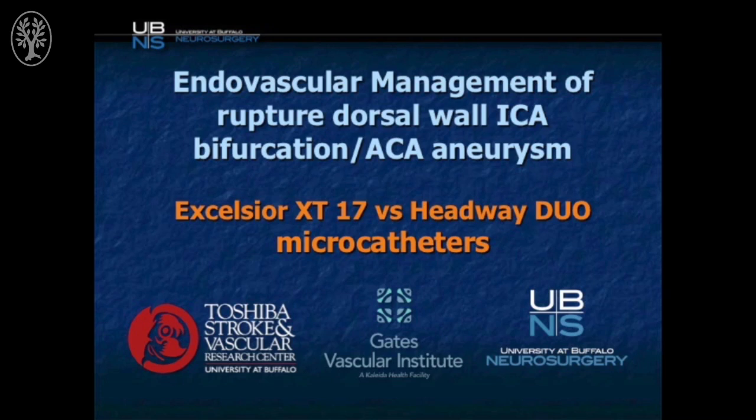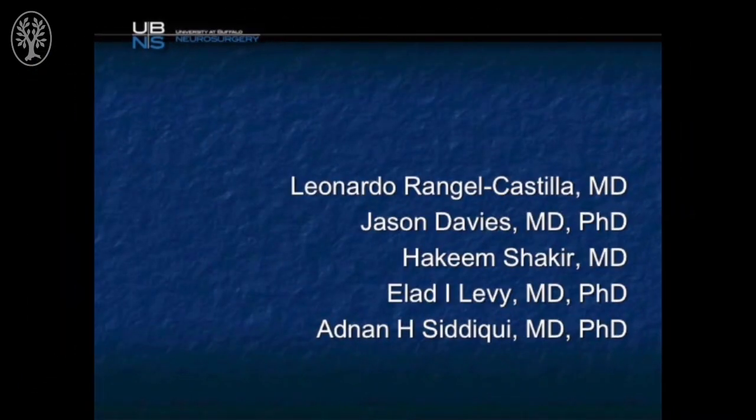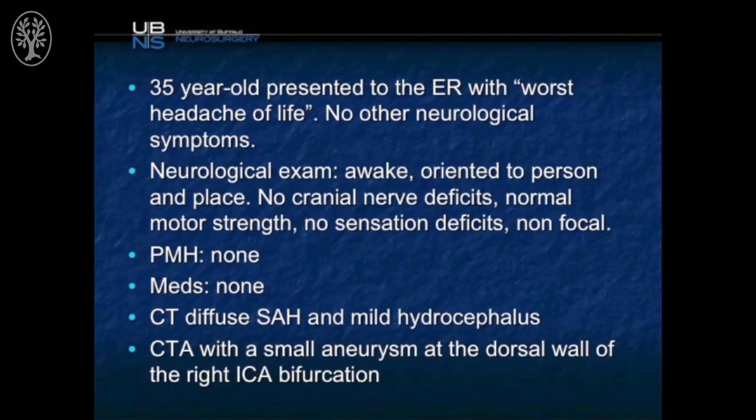This next case is the endovascular management of a ruptured ICA bifurcation aneurysm. We examine the properties of two different microcatheters in this case. This is a 35-year-old female who came into the emergency room with the worst headache of her life.